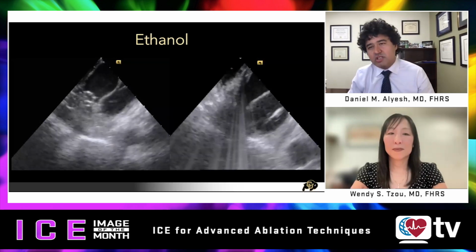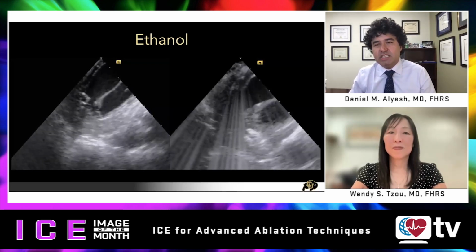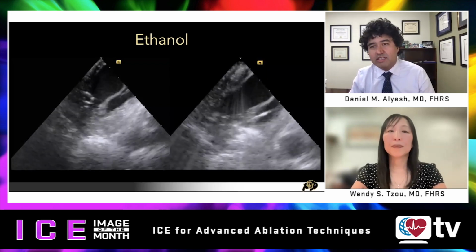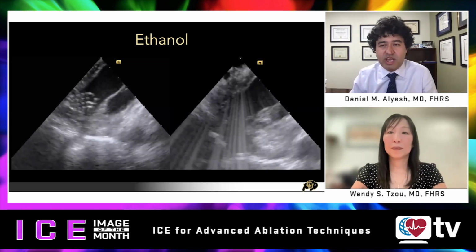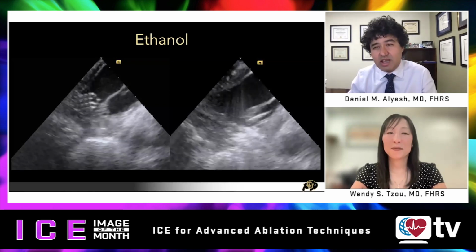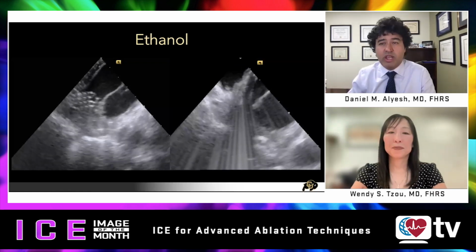There always is the question of to what degree it is stunning versus a true durable lesion. And I think the LV Summit area, despite it being so vexing, is not huge as far as anatomic real estate, so clearly a great result here.